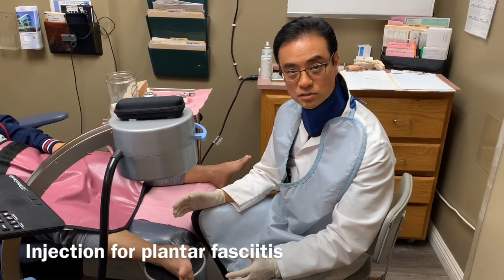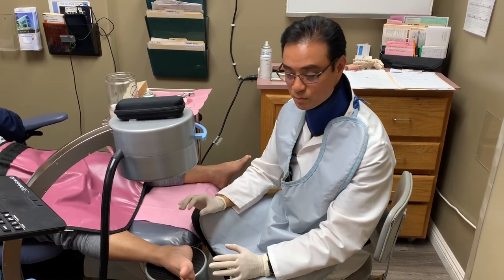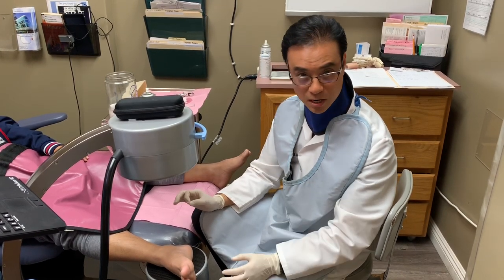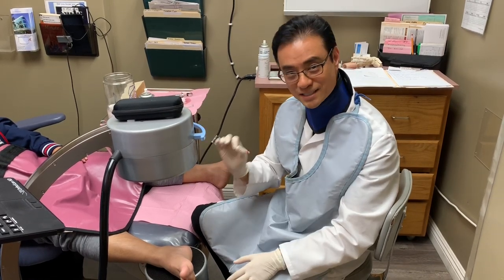This is a plantar fasciitis, or what people call heel spur syndrome. My patient here doesn't have a heel spur, but he has plantar fasciitis with lots of pain where it attaches into the bottom of the heel bone. So I'm going to go right to that area and give an injection using this machine so we can locate exactly where to go.